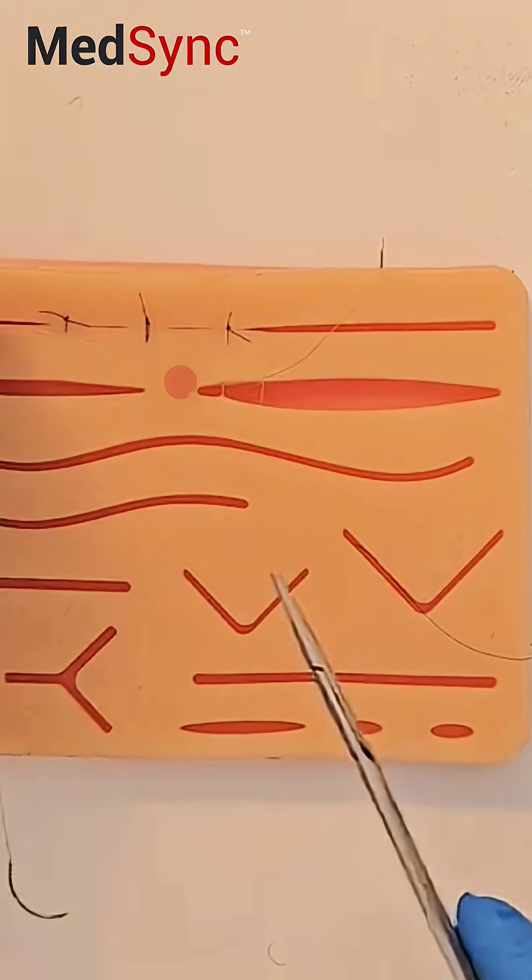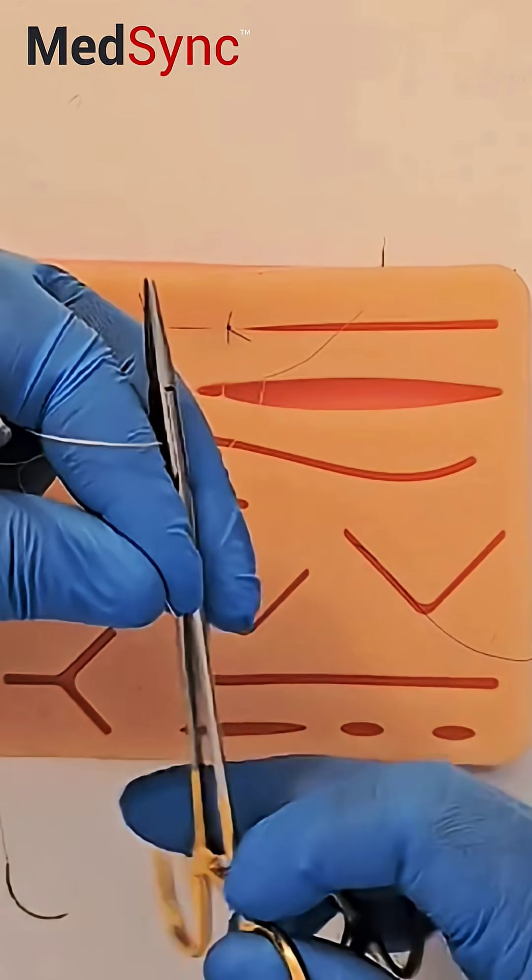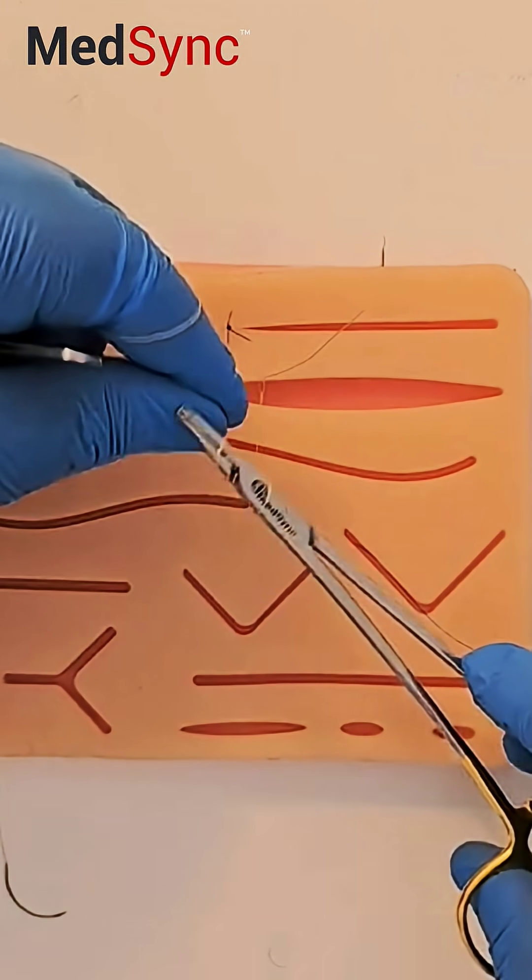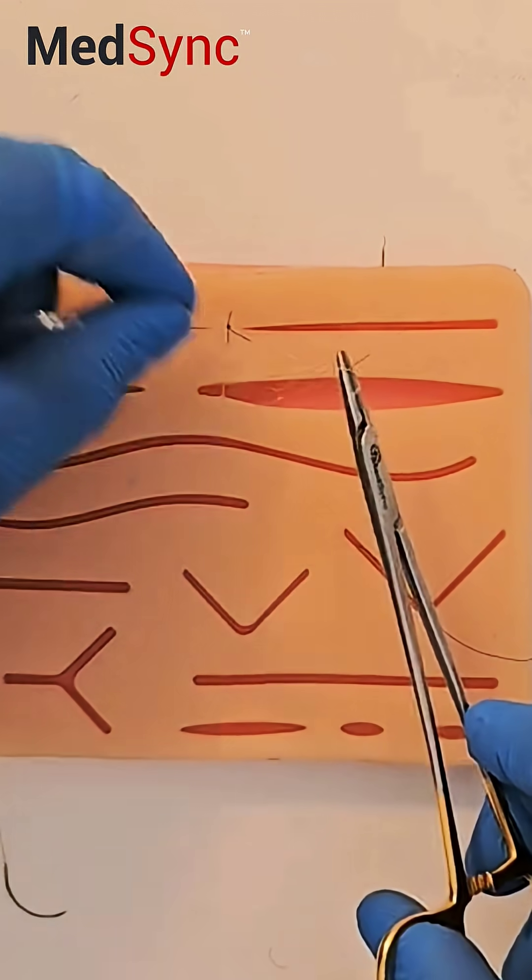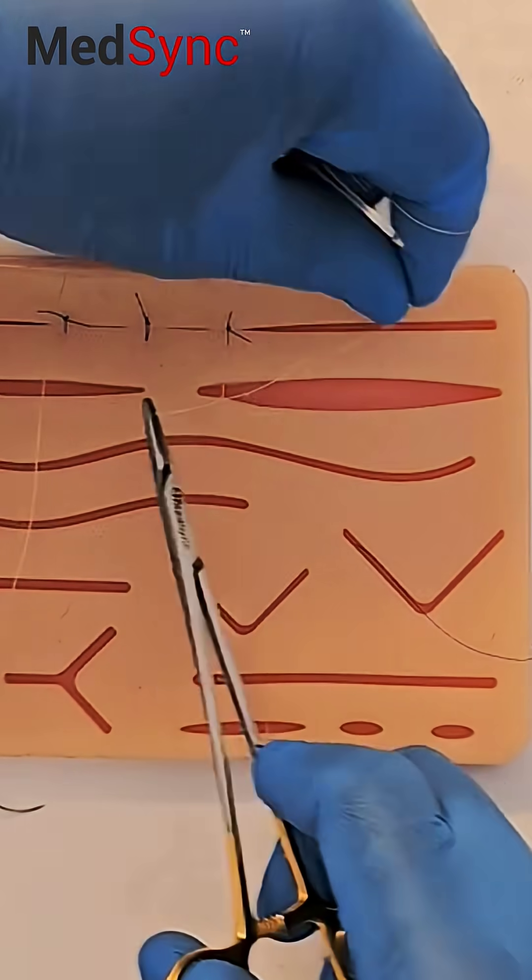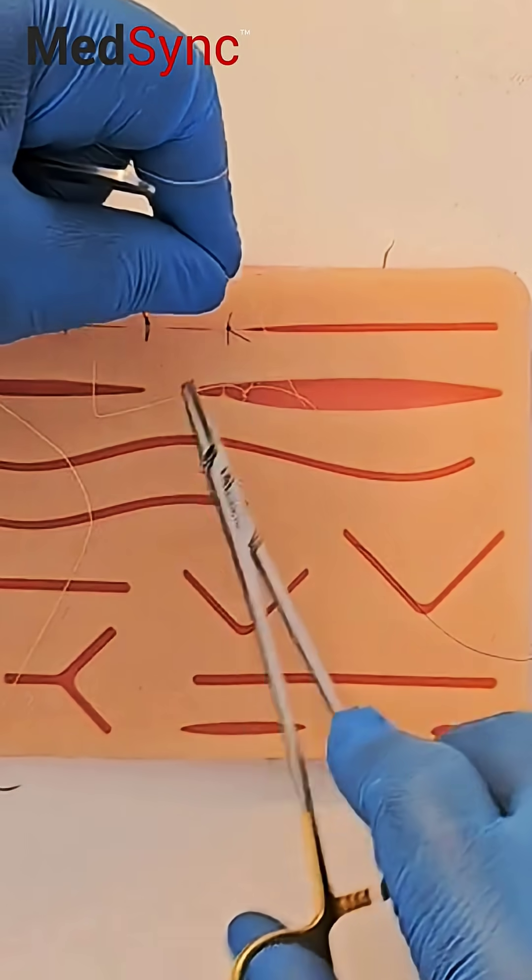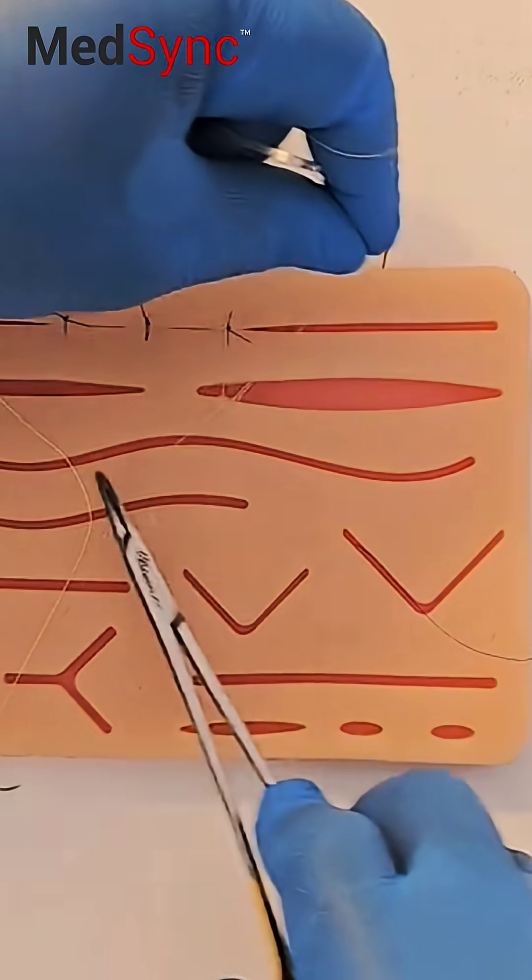So now I've got a long and a short end, same thing applies. I'm going to do two revolutions, then one revolution around the needle holder, one, two, but this time you lay the knot parallel to the wound. It's opened a bit, it might pull out.